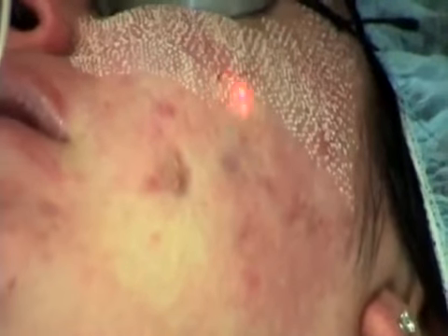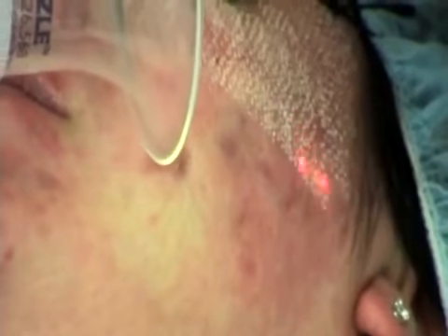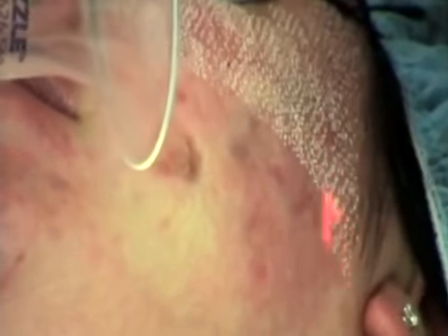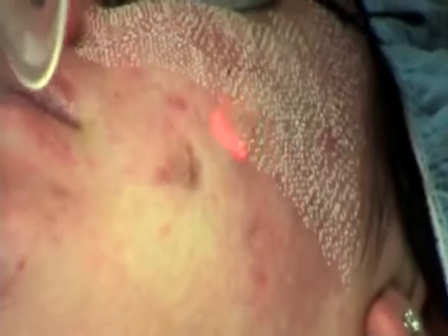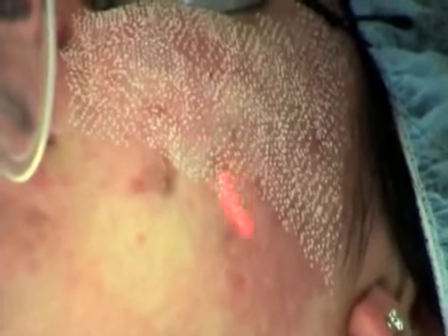Here, the treatment area is being first treated with the Active FX, which is a little more superficial than the Deep FX. Non-overlapping pulses are laid down over the entire treatment area. A smoke evacuator is used in the area to clear the plume. In addition, cold air may be blown across the surface area to increase the comfort of the procedure.